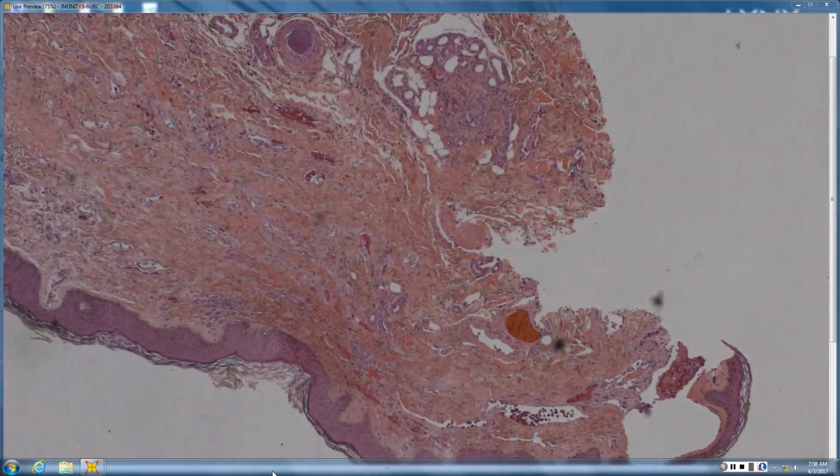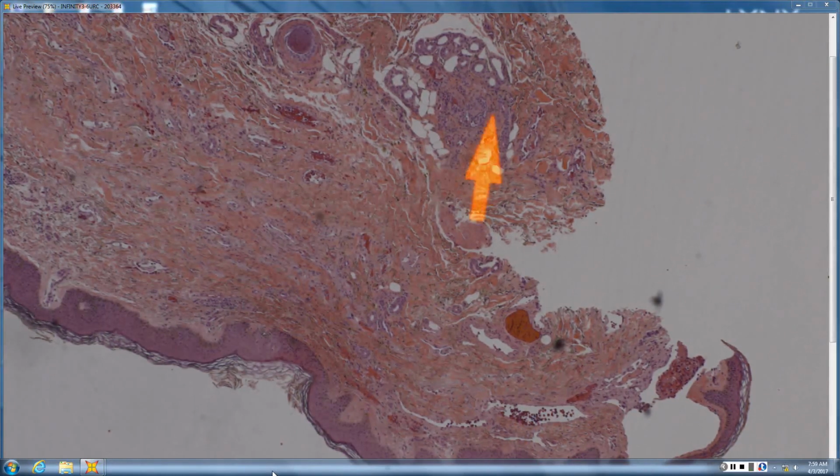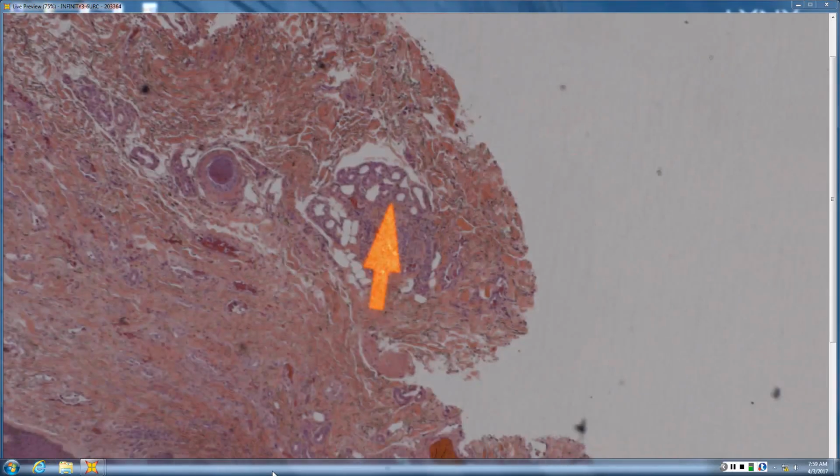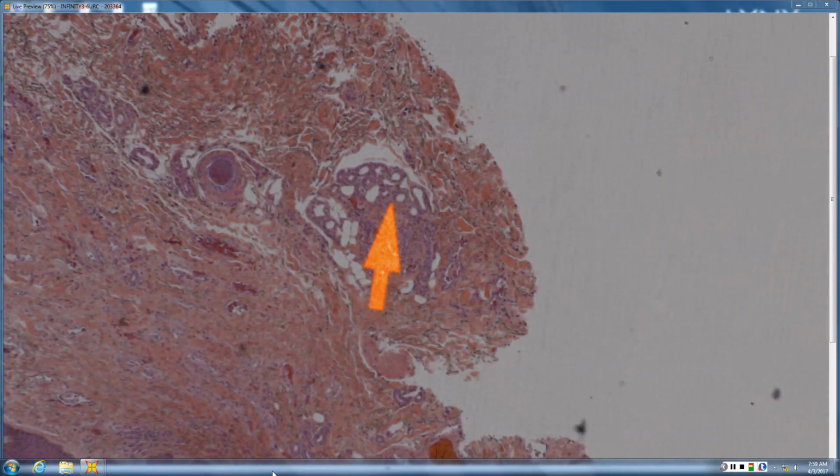So you have a proliferation of vascular spaces, some of which are slit-like through the dermis. Up above, they tend to be very large and staghorn, and down below, you have a patchy proliferation around the eccrine coil. So what are you thinking? Is that the eccrine hemangioma, or the eccrine angiomatous hamartoma?